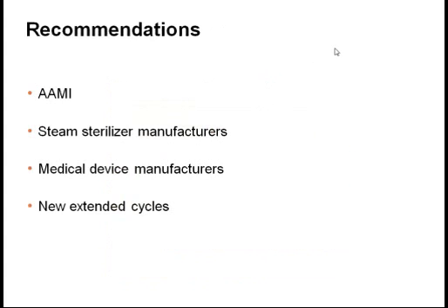Changes in the device manufacturer's recommendations on the selection of sterilization parameters have added new challenges to sterile processing departments. Based on the mode of steam sterilization used, steam sterilizer manufacturers provide recommendations for minimum sterilization parameters and the types of items being sterilized. Medical device manufacturers have revalidated their complex medical devices and complex tray configurations, establishing new recommendations. While the steam sterilizer manufacturer can make minimum parameter recommendations based on their testing, the device manufacturer has the final word on sterilization parameters based on the validation testing of that device.